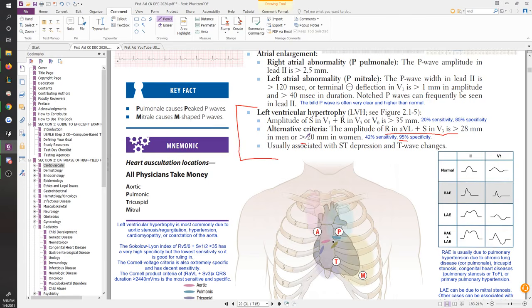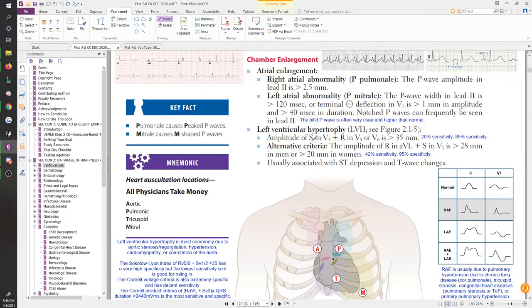If you ever have a question on these things, hopefully there's going to be a little more about it than on your actual question stem, and you'll have some more information to base it off of, right? Left ventricular hypertrophy. So don't worry about that stuff too much. Don't worry about this stuff too much at all. I personally have yet to really use it on any practice question that I've done with any students, so don't worry about that. This has shown up though, the atrial enlargement stuff.